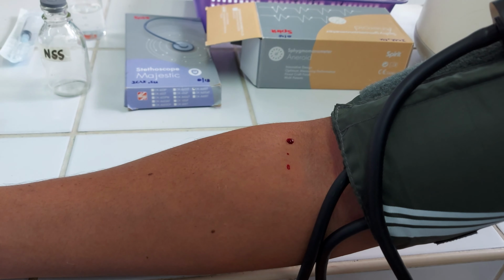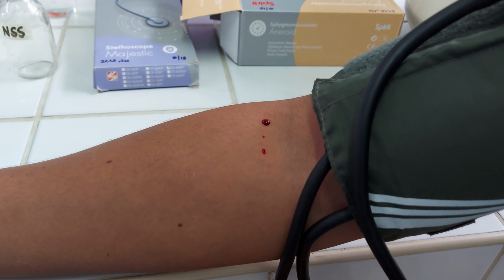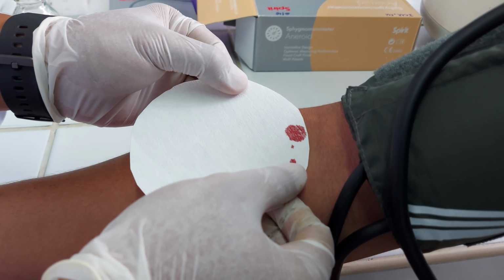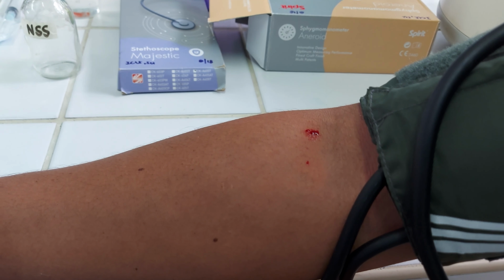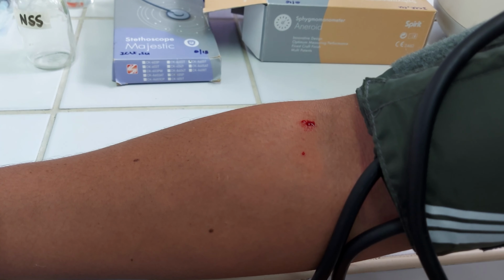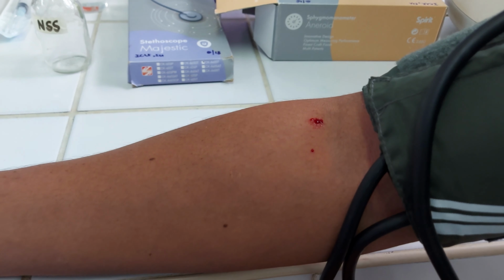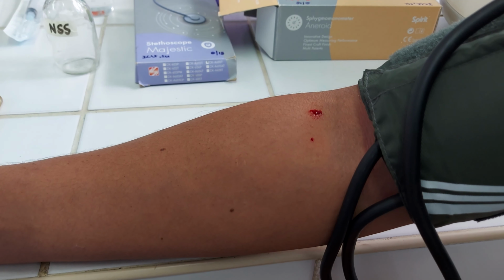Next, you hold the skin tightly and make 3 small punctures about 3 millimeters deep and 1.5 centimeters apart. Now, start the stopwatch. After starting the stopwatch, you blot the blood at 30 seconds interval using the filter paper. And as always, you move the filter paper so that each drop of blood touches a clean area. Stop the stopwatch when the filter paper no longer shows signs of blood. The average of the times for bleeding to stop from the 3 puncture sites is recorded as the bleeding time.